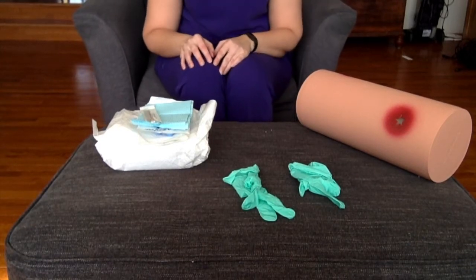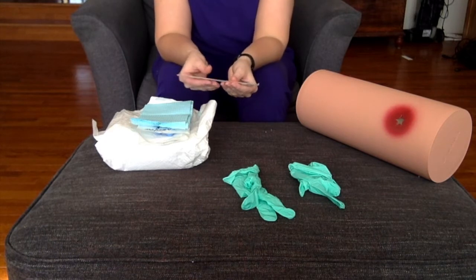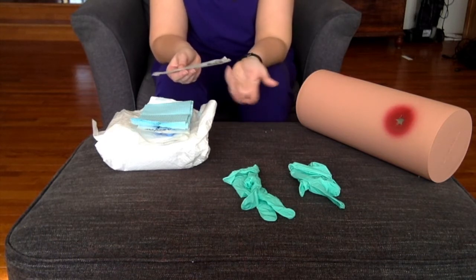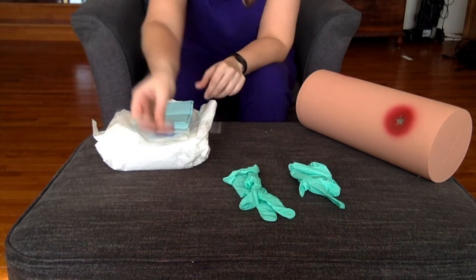Hey guys, it's Professor Sears. We're going to go ahead and do a little bit of wound care today just to give you an idea of the skill itself. I'm not going to go through all the steps on the checklist but we'll talk through the actual procedure that you have to perform.